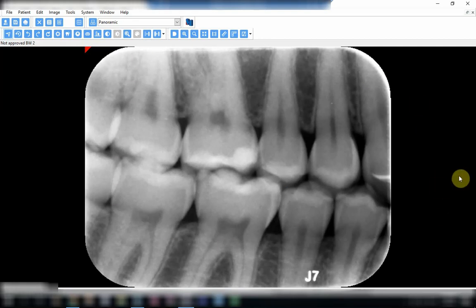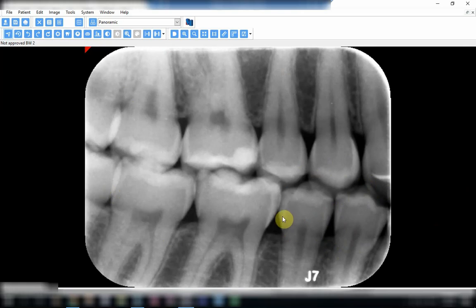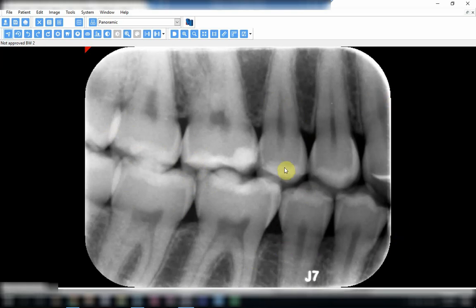In this next radiograph, the coverage is complete — there is no cone cutting. The x-ray has passed correctly in between the teeth; you can see how beautifully the contacts are separated. However, when we go to the molars, there is a fairly considerable amount of overlapping. The alveolar crest and the interproximal surfaces of the molars overlap.